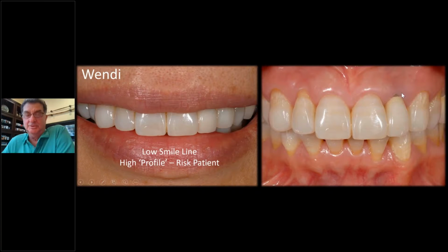So, this is against all my principles, but it's not a totally high smile line. And I discussed it with her. I said, listen, we have some new technique that we're doing that we might be able to get an implant in and put a temporary on the same day so you don't have to walk around with a flipper or an Essex retainer. And she said, but it might allow recession, but you may not show it. So she knew that, and I put it in writing.